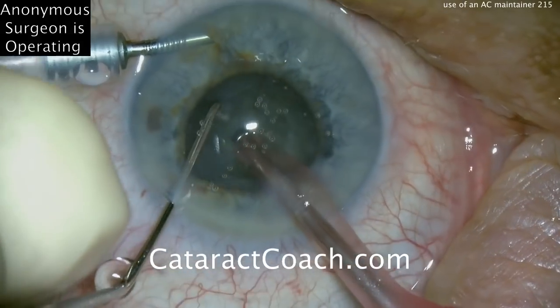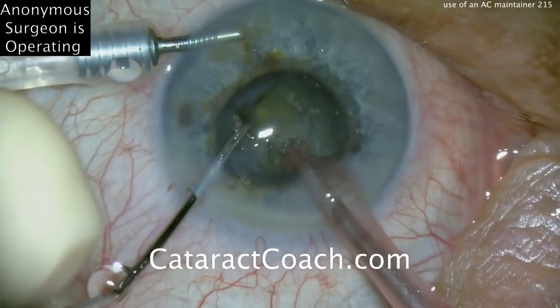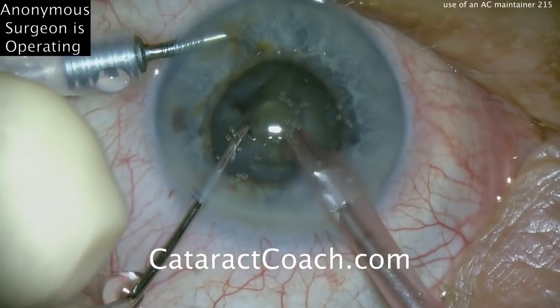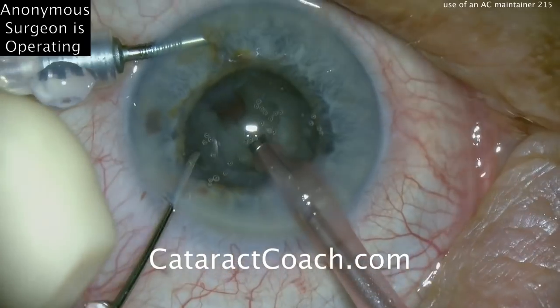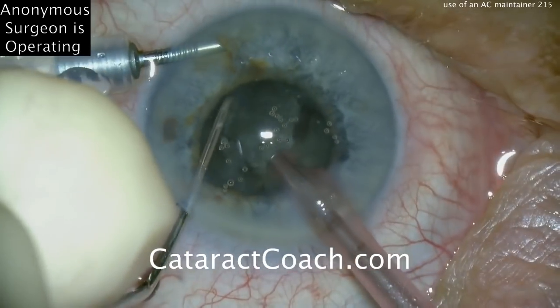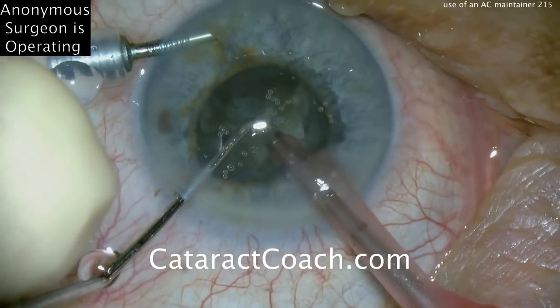The surgeon is doing a good job of holding the nucleus and going around the nucleus equator to chop, and there's a little piece coming out. This is a stop-and-chop technique: grooving down the middle, creating two halves, cracking them apart, and then sub-chopping each half. There's the nuclear piece, and then the chopper around it, and it can be aspirated down once chopped.